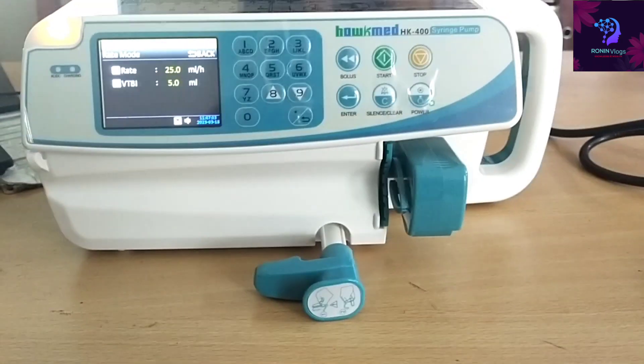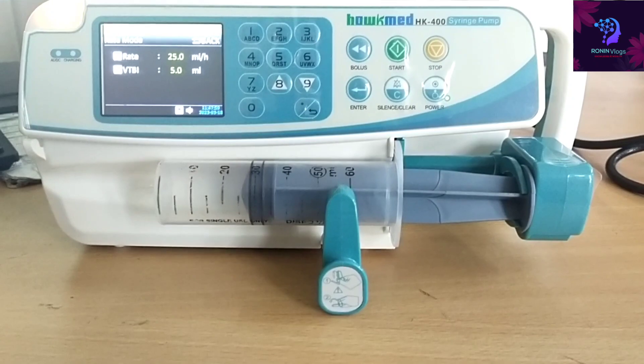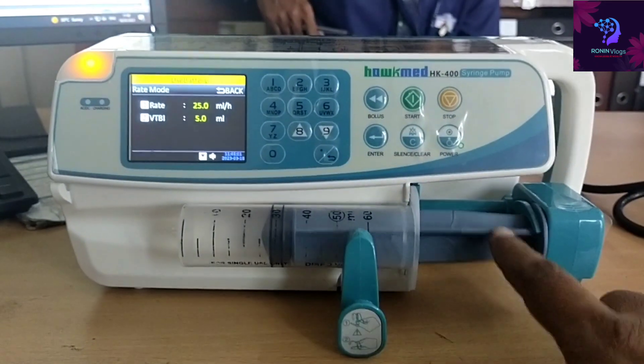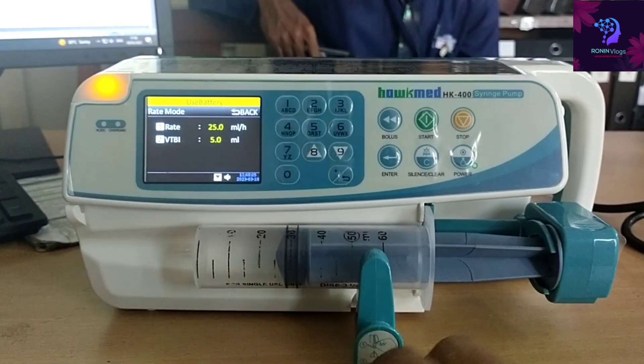The pump has two sensors — one sensor here and another one for the lock. Now I fix the syringe. This machine has another useful facility: it automatically detects the syringe size. After fixing the syringe, just press the start button.